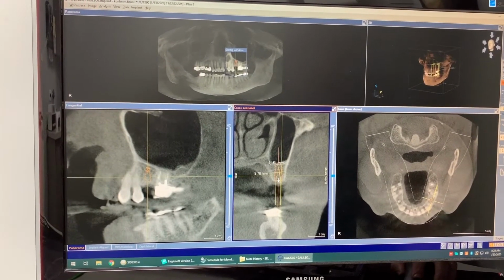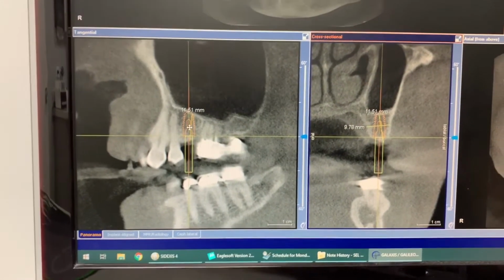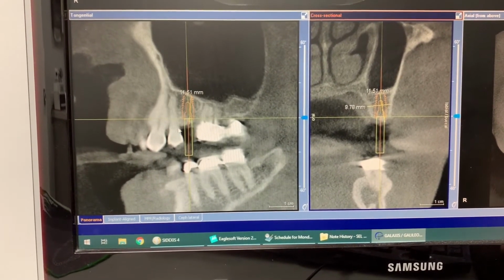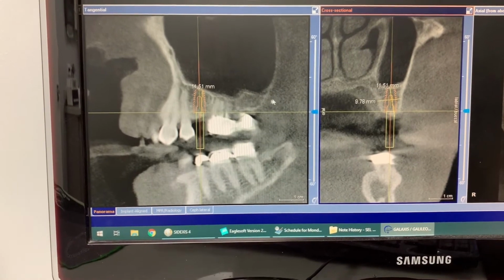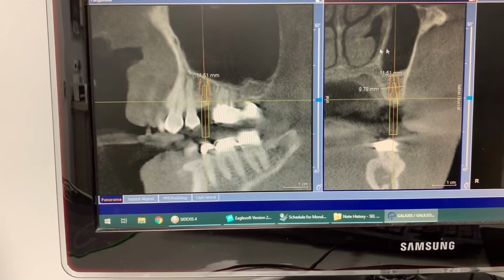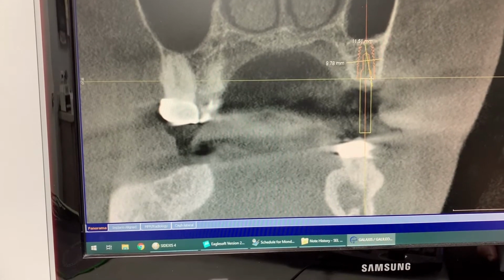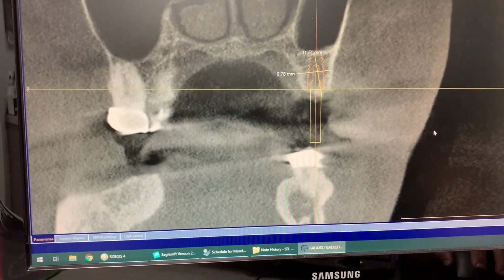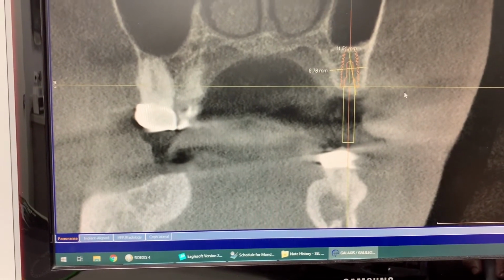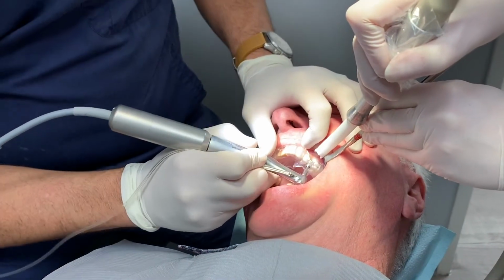So here we are, right at the floor of the sinus. And we can see here that we've got a lot of room. You can see it looks a lot more subcrestal than it really is, because when you look at this tangential image, it's only giving you 1 out of probably 50 slices. So the cross-sectional is kind of where it's at. And so you can see here, we're just a little bit below the level of the crest. And you have an 11.5 ready in case. Just in case, I got 11.5 just to keep Dr. Nisnik happy.